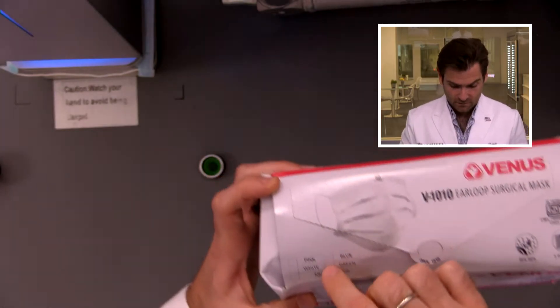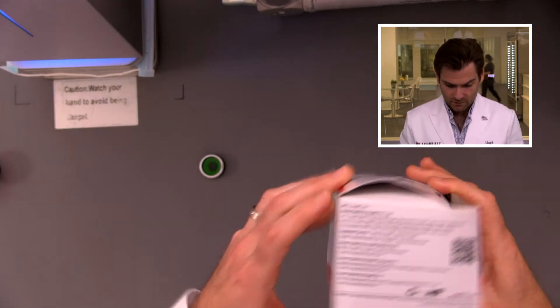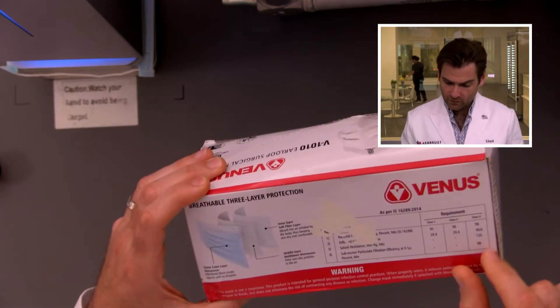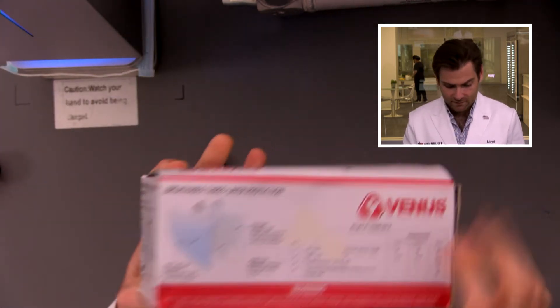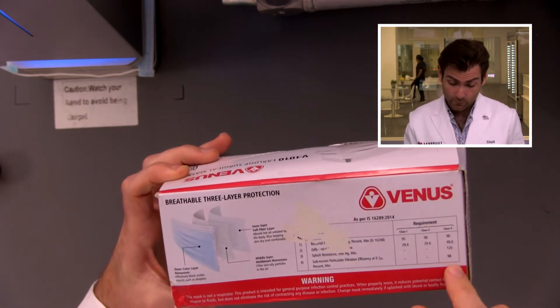0.1 microns, which is actually closer to the size of the coronavirus — interesting. Let's take a look at the box. They've got check marks, someone's doing this by hand — customer care okay. They're not saying what type it is, they're just putting the different classes. Oh, they're saying it's class two — this must be an Indian standard, I'm not familiar with it.